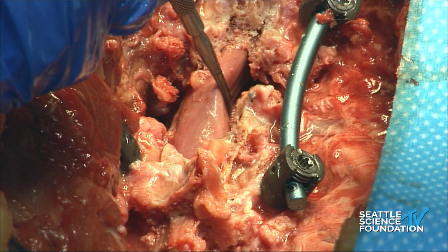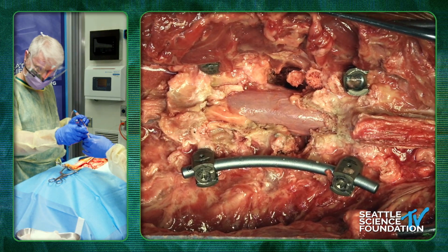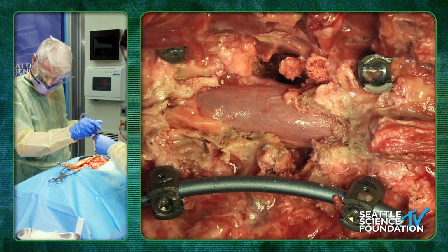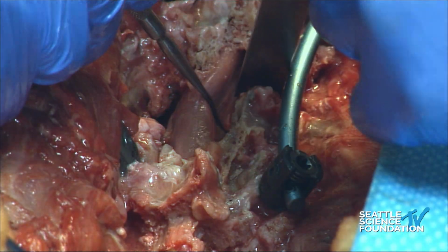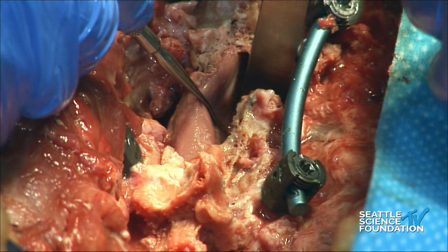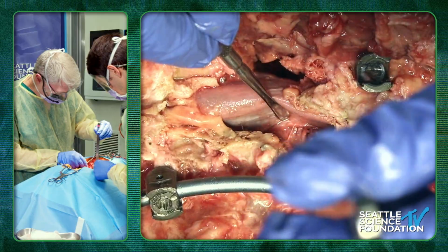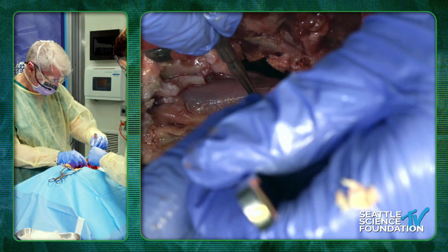Okay, and now what we're going to do is we're going to finish the osteotomy on the other side. So here, I'll take that. And I want you to make a cut kind of like that, okay? So I'm going to help you. We'll retract this gently. So you've already cut into the disc, so cut into the disc so you know where you are. Good. And now we're going to make your triangle cut. You're going to meet my cut by cutting that way.